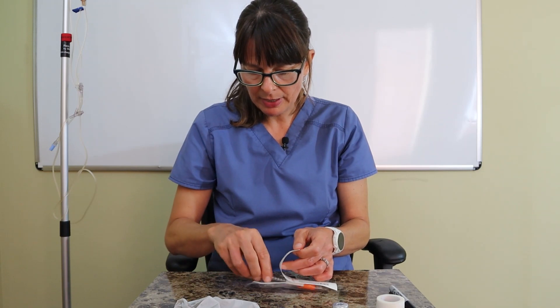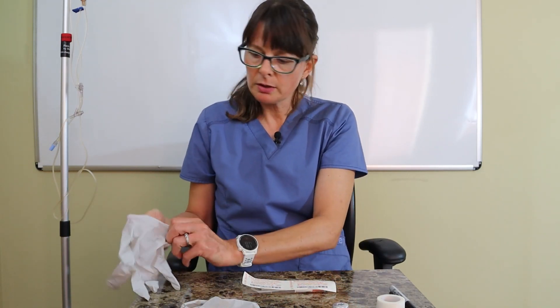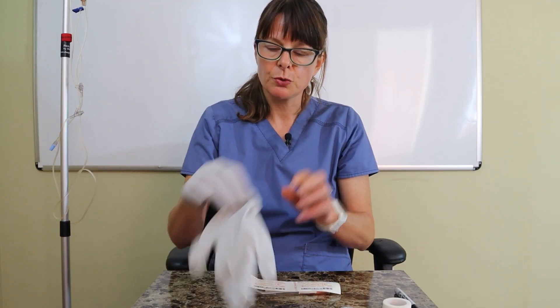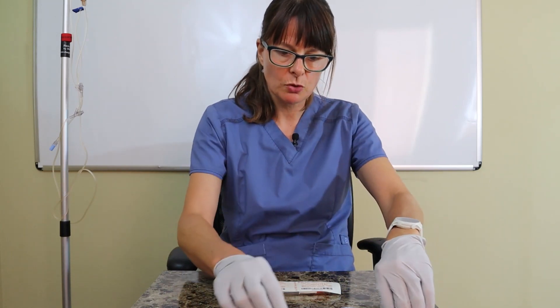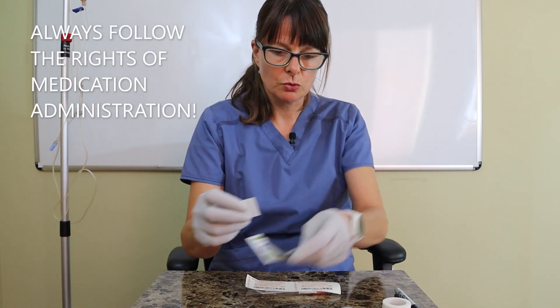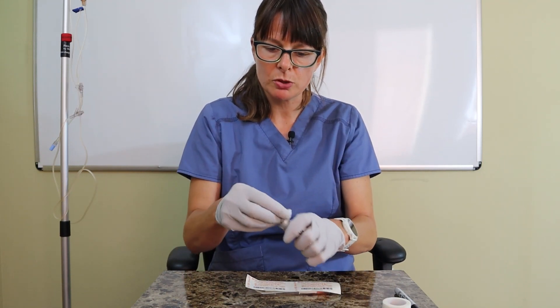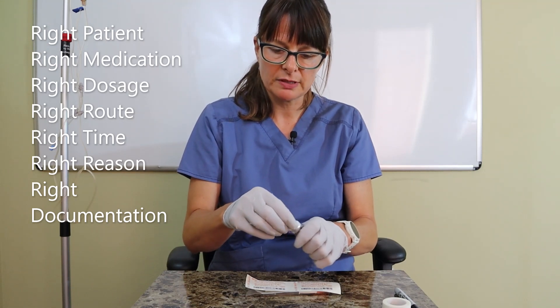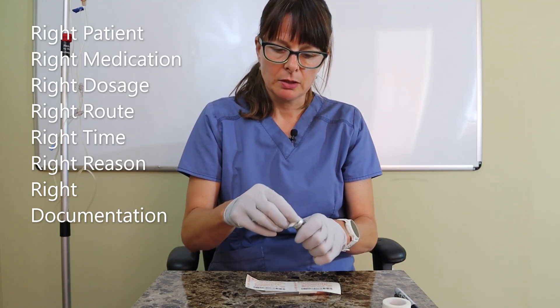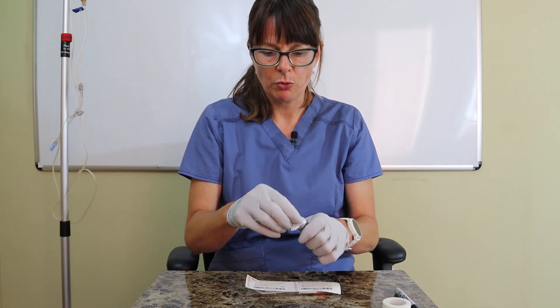I'm going to put this back and put on my gloves. Insulin vials are usually multi-dose vials and are kept in the refrigerator after they've been opened at the facility. As always, I want to clean the rubber stopper of the insulin for about 10 to 15 seconds vigorously so that any contaminants are removed.